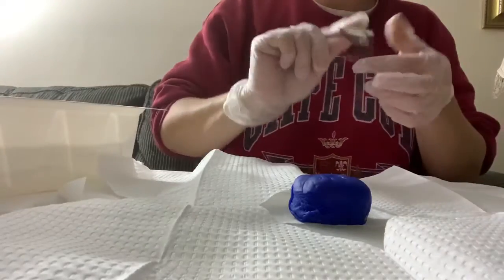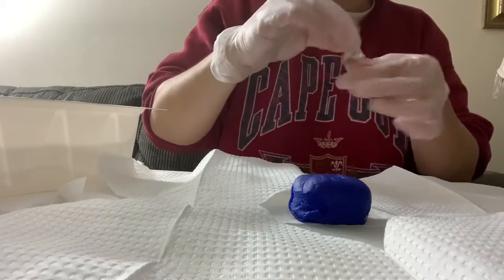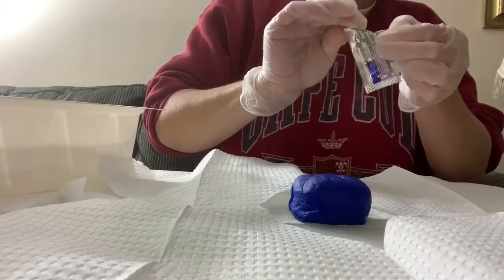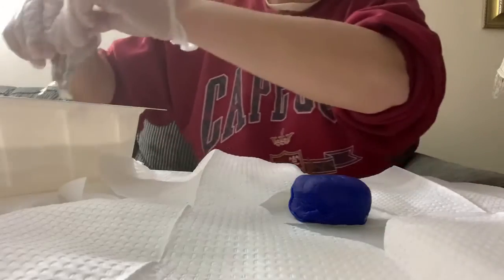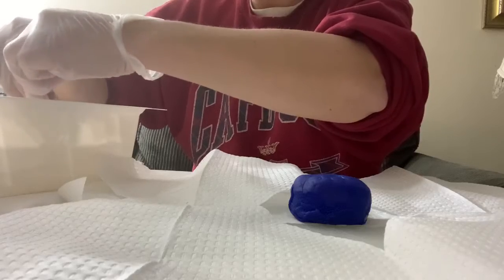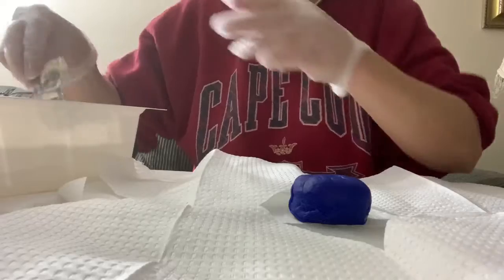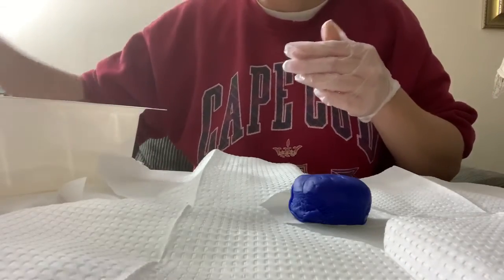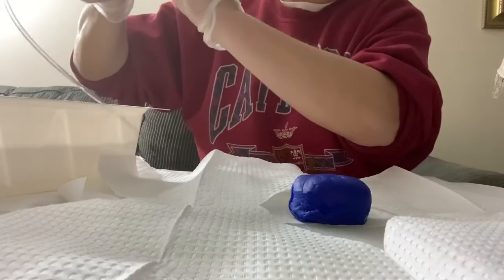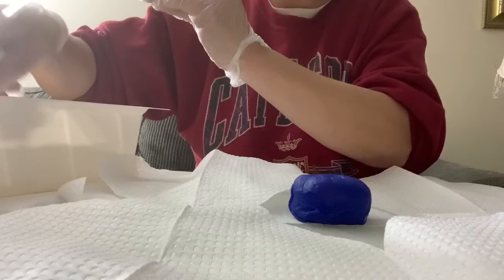I also have lubricant, so I'm going to open my lubricant. And I'm just going to pour a little bit into the bottom of my kit. And I have my catheter, and I'm just going to run the end of the catheter through the lubricant.